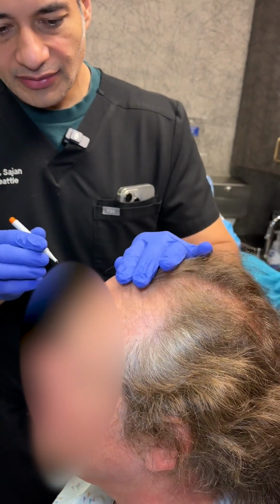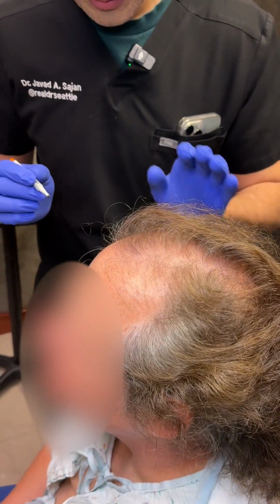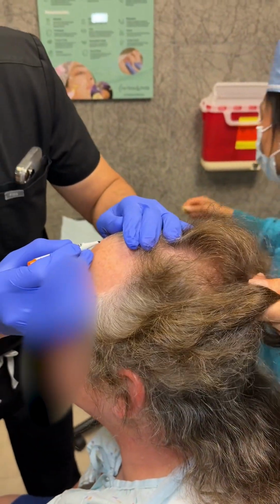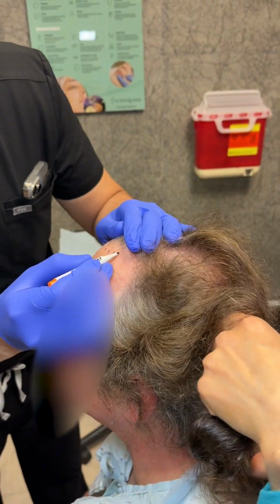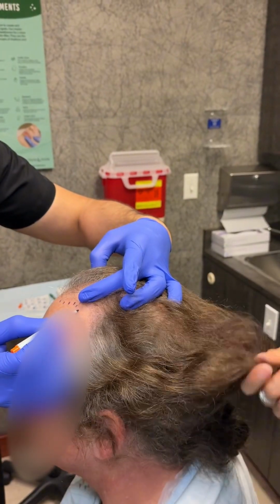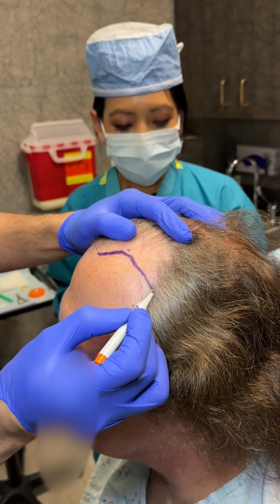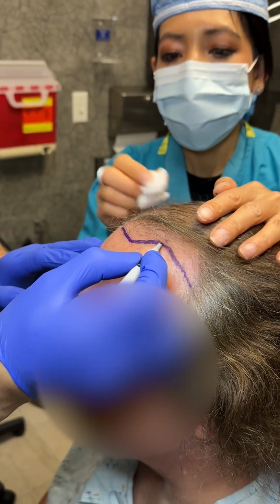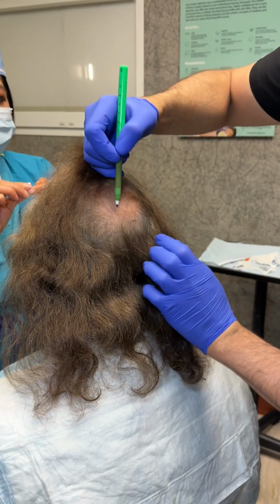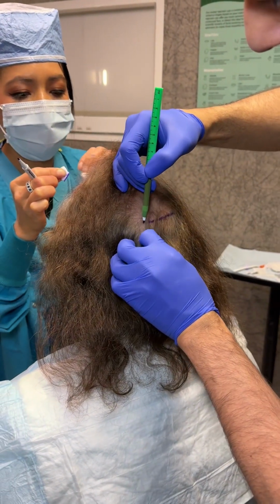All right, today, friends, we're doing a 3000 FUT or follicular unit transplant. We're going to be following our patient's amazing hairline and giving her thicker and fuller hair. We're going to fill in where she's missing hair, which is the crown area. We're going to round out the hairline. And for the crown, we want to fill in this area that gives our patient discomfort and make that more full.